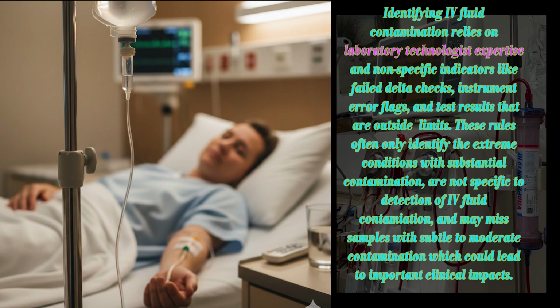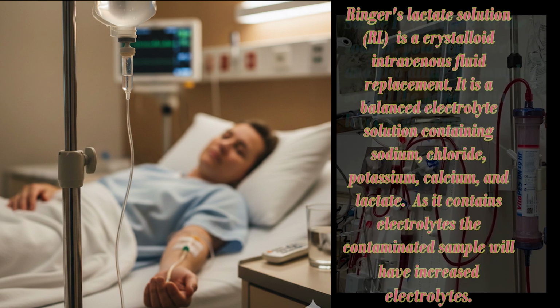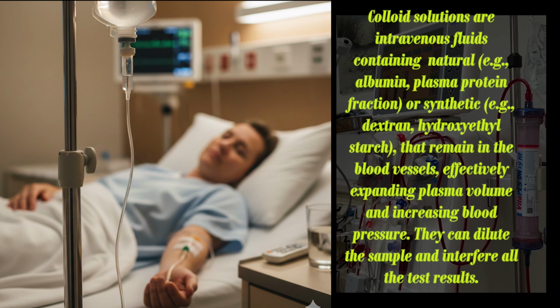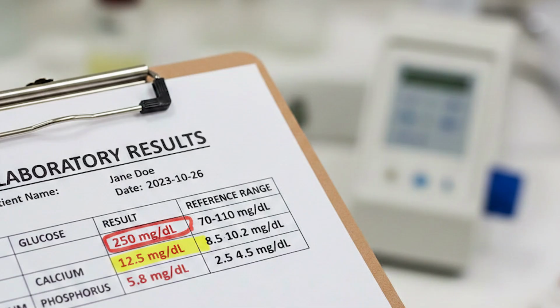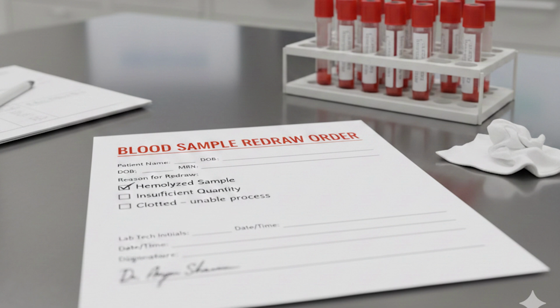The second method of contamination is from the IV fluids. The sample collected from the same arm getting IV fluid can get contaminated with the fluid. These samples are diluted and interfere with glucose, calcium, electrolytes results. These can be detected with the previous results, very abnormal results, or with hemoglobin results from the sample collected at the same time. Any IV contamination should be reported to the other sections to alert them not to report the results. All contaminated samples should be redrawn with special instructions and rerun with a new sample.